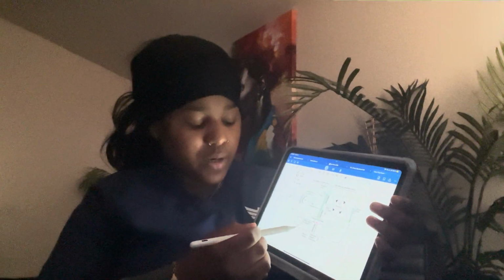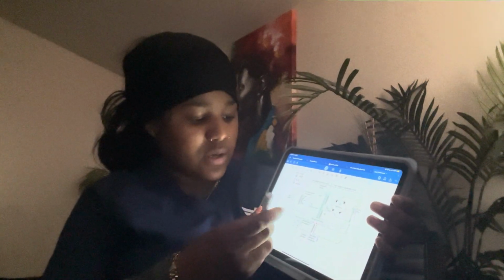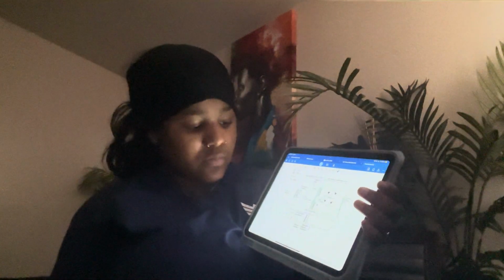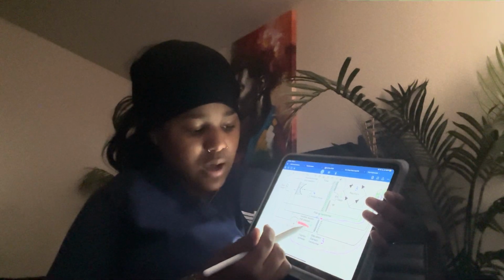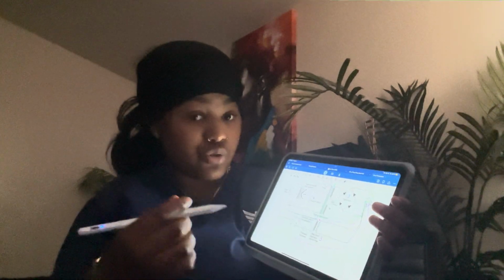The variable resistor is what produces that part of the mA. So when we're including 30 mA, that's where this is taking place. The mA selector is what enables the milliampere settings, which controls the tube current.